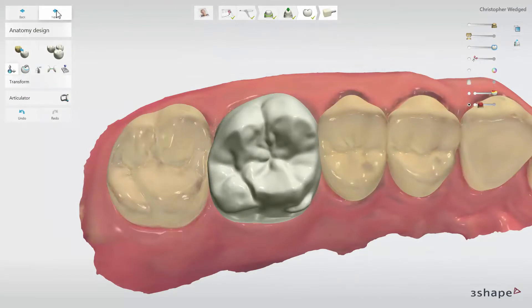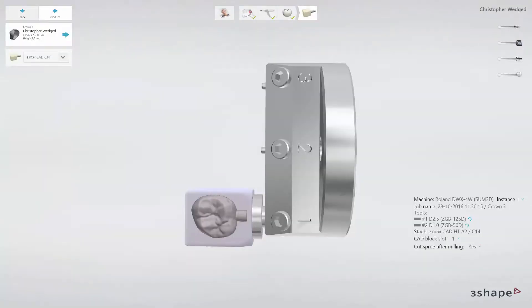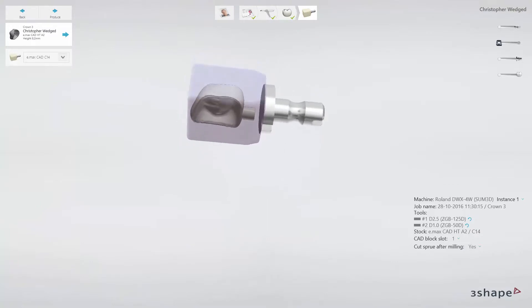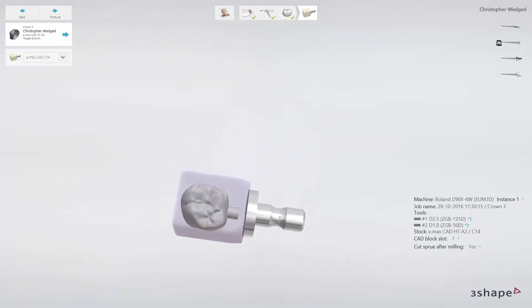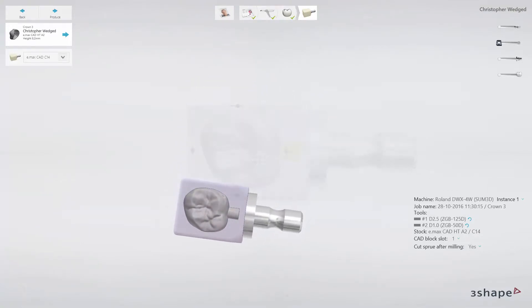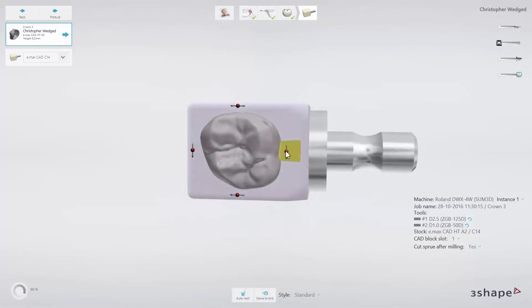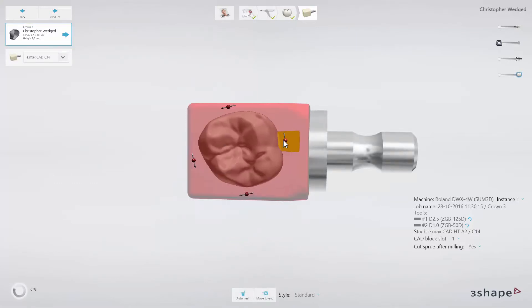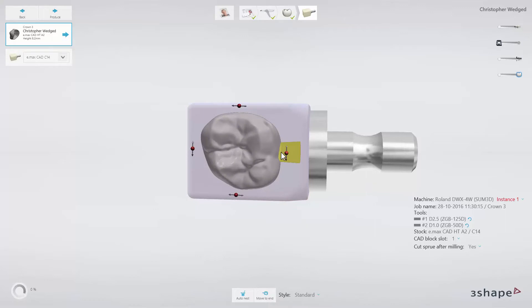Having a design ready, go to the CAM module, where your restoration will be automatically placed in a milling block compatible with the milling machine integrated with your system. Manual adjustment is always possible. If placement is satisfactory, click on Produce to have the CAM file sent over to the milling machine.